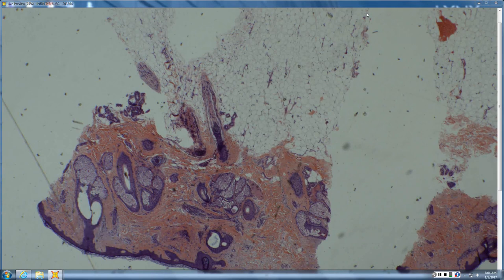Well said. And the hairs, are they big strapping terminal hairs? No, they are rather vertically challenged. That one extends down into the fat, but the rest is... But is it a big strapping hair, or is it a pretty puny hair? So punification of the hairs goes with? Androgenetic alopecia. Androgenetic or? Alopecia areata. Or? Syphilis. You are correct, sir.